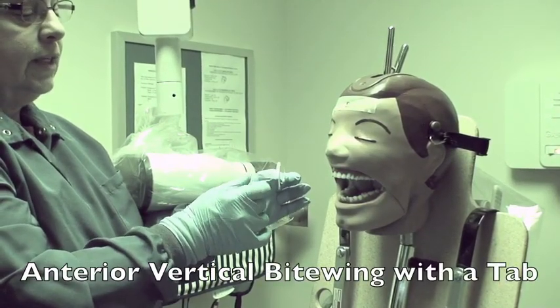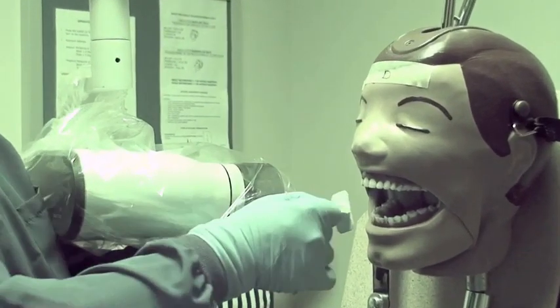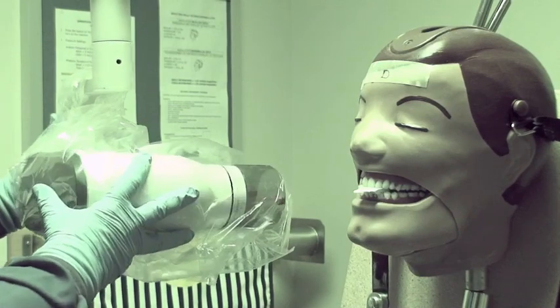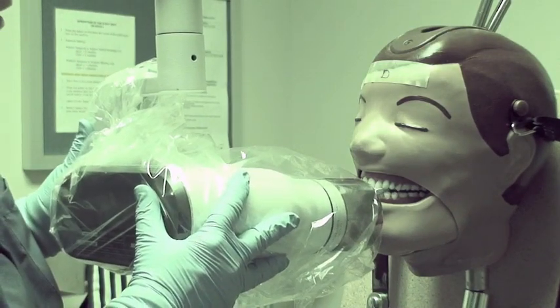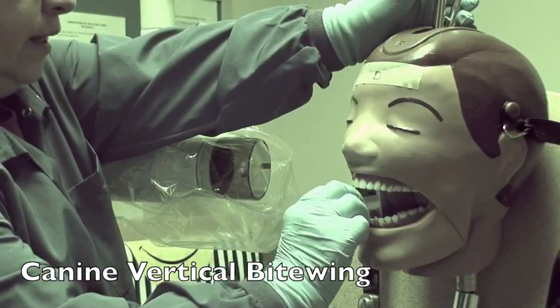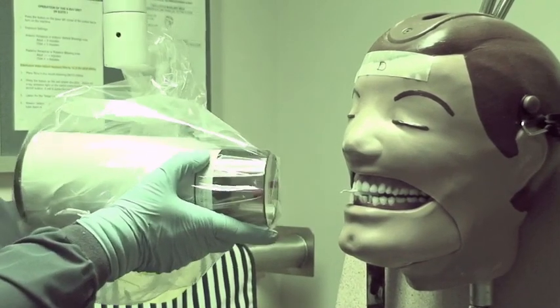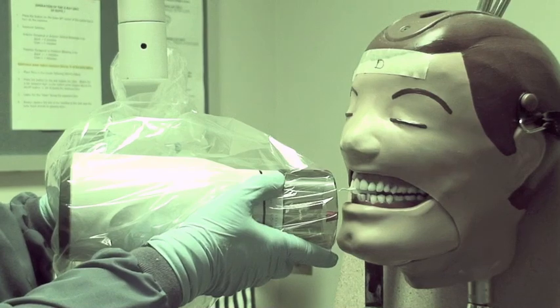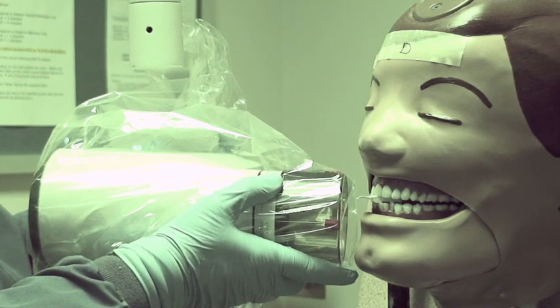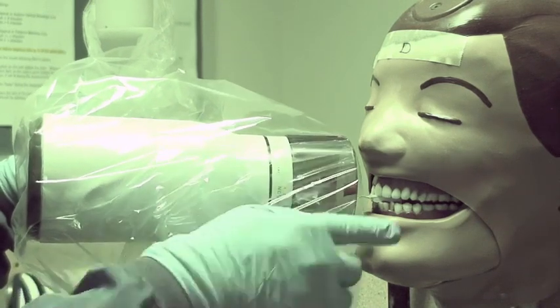When using the paper film, you have to use a sticky tab to extend it. We're going to use number one film on the anteriors because of the mannequin. Seat it on the lower arch and have them bite edge to edge for the anteriors, then aim between the contacts of the centrals. For the canine view, center the bottom canine and have them bite. You can either aim between the lateral and the canine to get the mesial contact open, or come from the distal to get the distal contact open, which should show up on the premolar view. Aim between the canine and the lateral, come up, then check your occlusal plane.